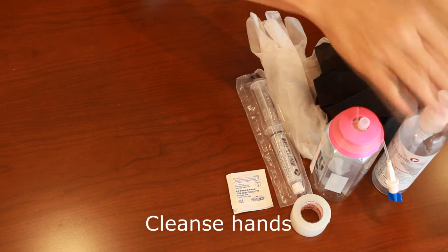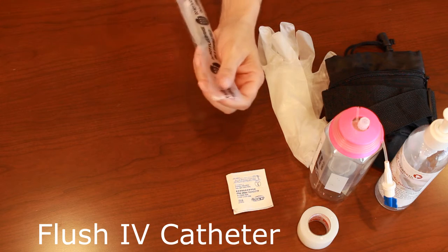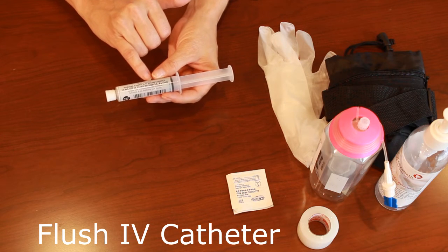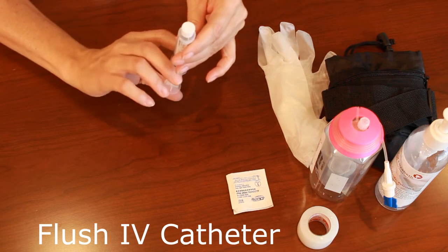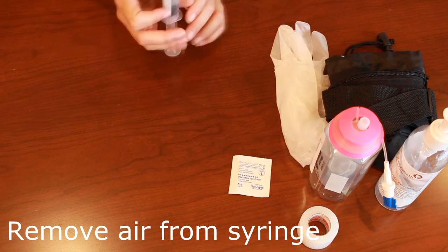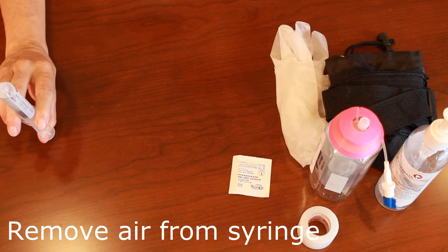Wash your hands as per your protocol. Now you need to flush your catheter to make sure it is working well. Open your saline pre-filled syringe — 0.9% sodium chloride is the solution we use. Read the label on the syringe to make sure you have the right solution. With this syringe, there is a bit of an air seal, so you need to push up on the plunger until you feel and hear a pop. Remove the cap, making sure you don't touch the junction. Once you've removed your cap, hold the syringe upright and push on the plunger to expel any air until you see a bubble at the top.